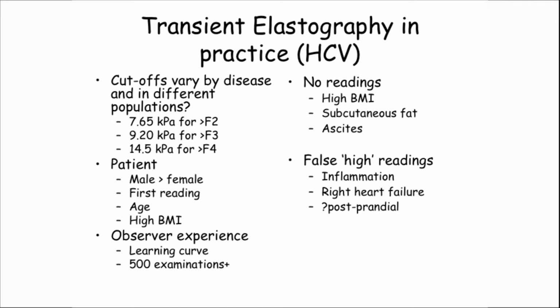There is observer experience and a learning curve, and it's thought that you need to do at least 500 examinations before you become proficient at using a Fibroscanner. I don't think you need it to be that high, to be honest. People with high BMIs, subcutaneous fat, and ascites, clearly they won't be able to get readings from.